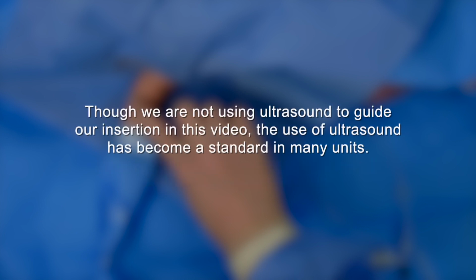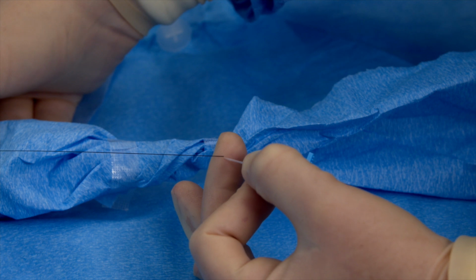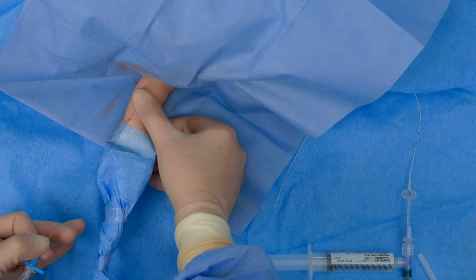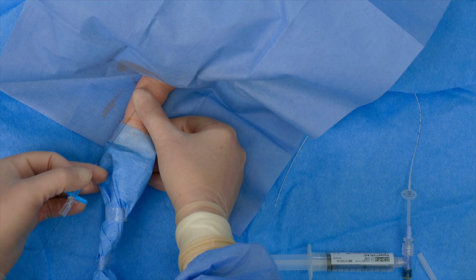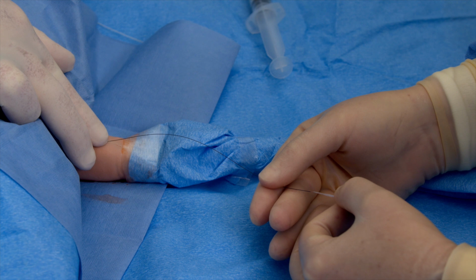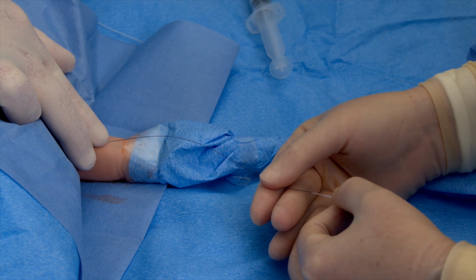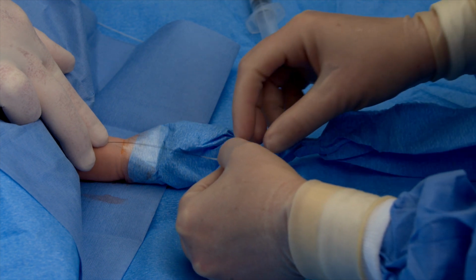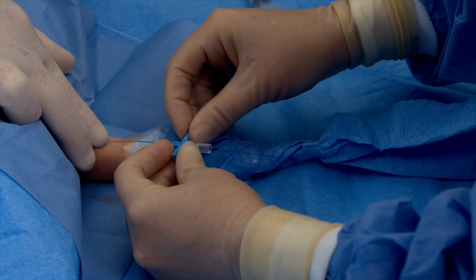Though we are not using ultrasound to guide our insertion in this video, the use of ultrasound has become a standard in many units. The sheath dilator assembly can now be threaded onto the guide wire. This can be tricky due to the small size of the dilator and the guide wire, so be patient. If you have a second person helping that is sterile, this would be an appropriate time to have them secure the guide wire at the insertion site while you use both hands for threading.